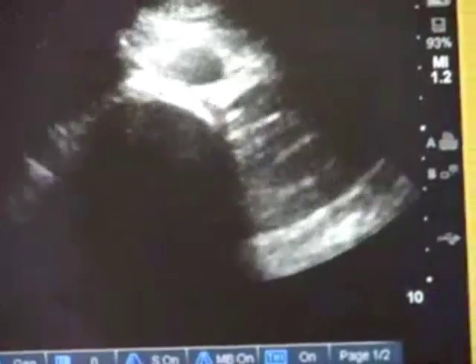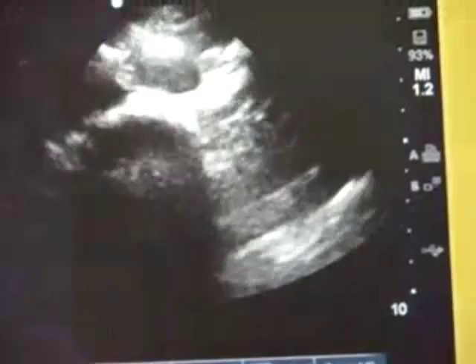As I walk down, I'm going to the point that the aorta bifurcates into the iliacs. And then I have interrogated the aorta in its entire length. An AAA cannot be ruled out unless the entire aorta has been evaluated.